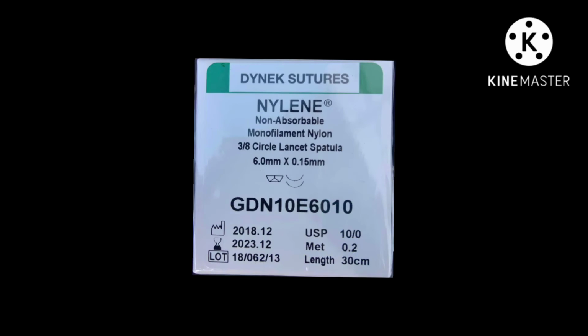The body of the needle is the portion grasped by the needle driver. The configuration of the body ranges from straight to U-shape. The point of the needle can be either cutting or tapered. Cutting needles have two opposing cutting edges and are used to penetrate tough tissue such as skin or fibrous scar tissue.